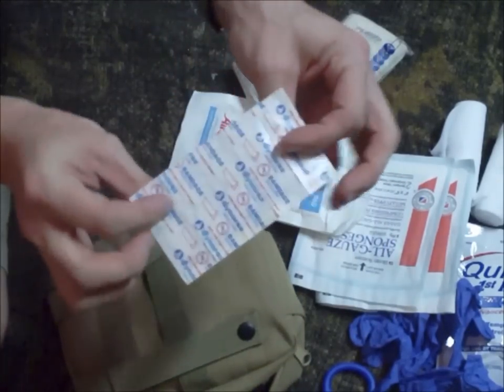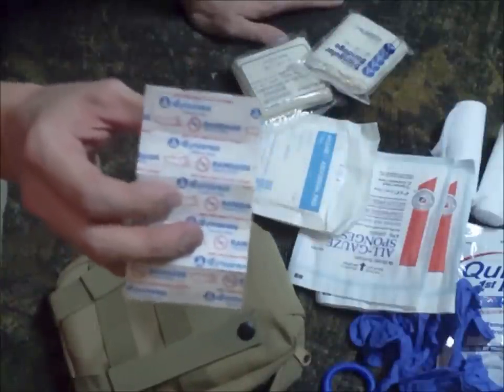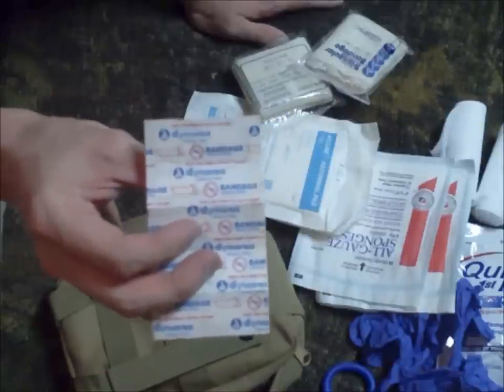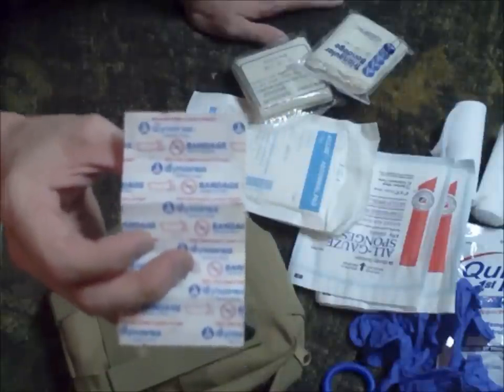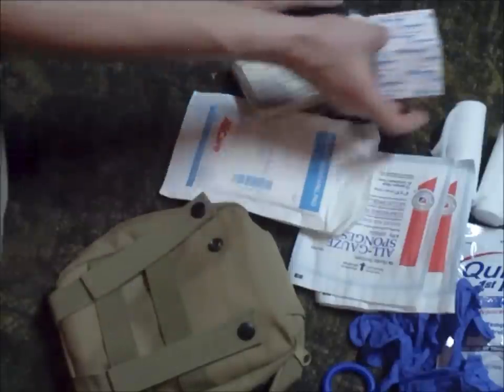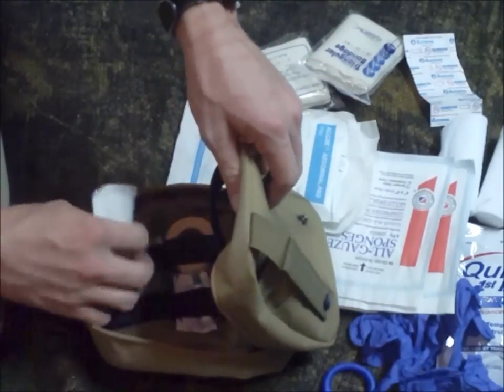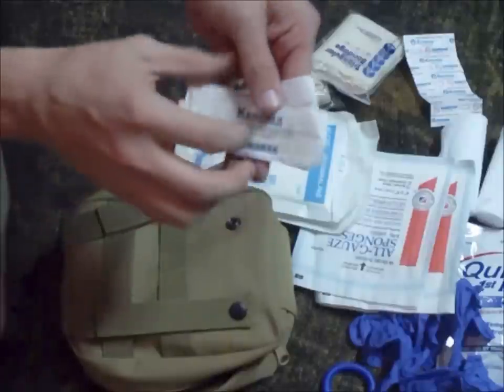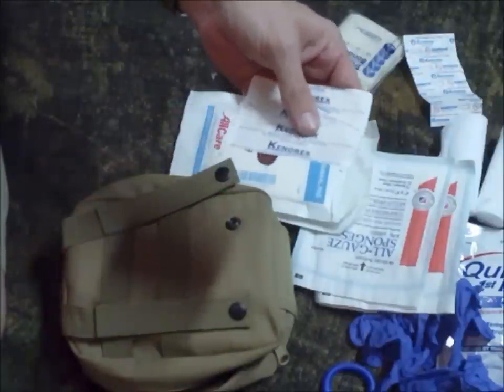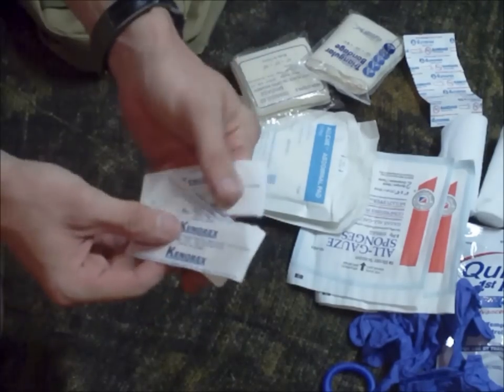I keep a couple of butterfly closures — these are great for closing up wounds that may need a stitch or two but you're not in a situation or area where you can go straight to get stitches. These help keep the wound closed and pull it tight. Of course every good first aid kit needs a few band-aids — that's the majority of what you're going to be using out of this anyway. Everybody always says 'I need a band-aid,' so keep a few with you.